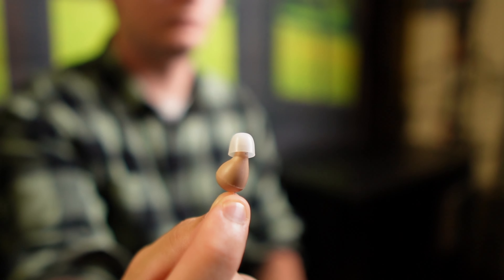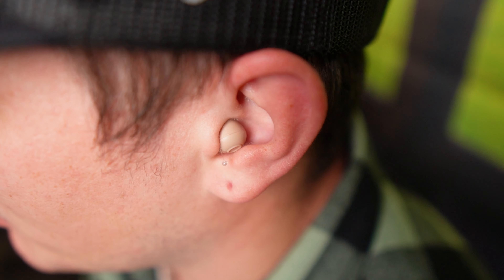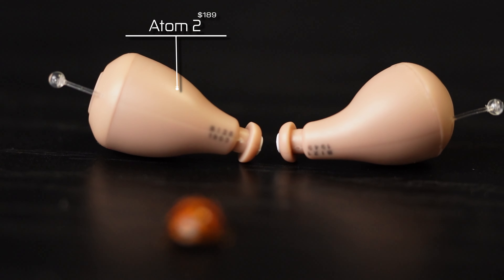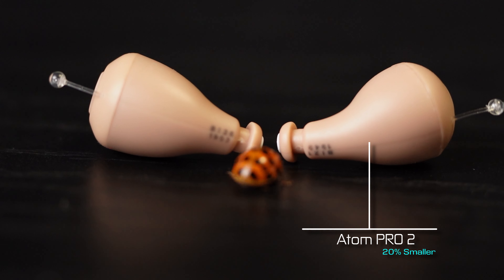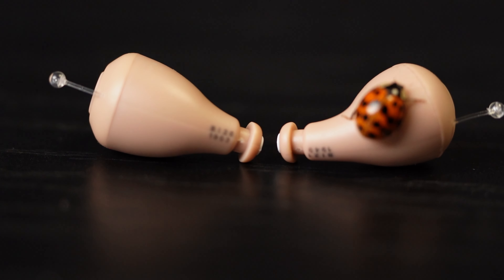Starting off, these are ITC style hearing aids — in the canal — and these are definitely the smallest over-the-counter hearing aids I've personally seen or reviewed so far. You could barely see these when they're in your ear. Here's a look at the Atom 2s when you're wearing them — $189, definitely hidden when looking straight on. The Atom Pro 2 is $100 more at $289 and is about 15 to 20% smaller — let's say 17.5% smaller. I would be really surprised to find a smaller over-the-counter hearing aid. These things are tiny.